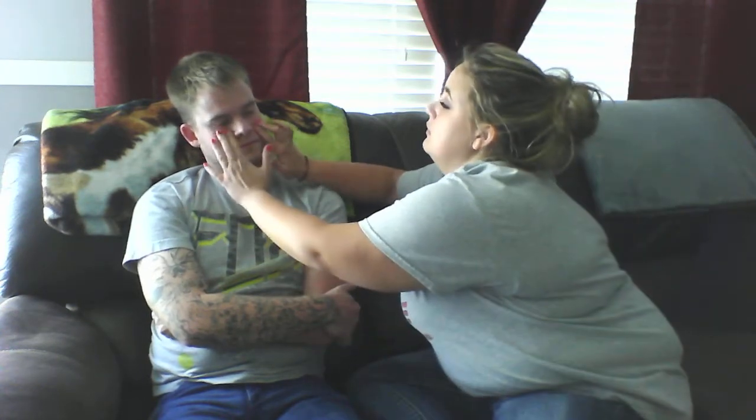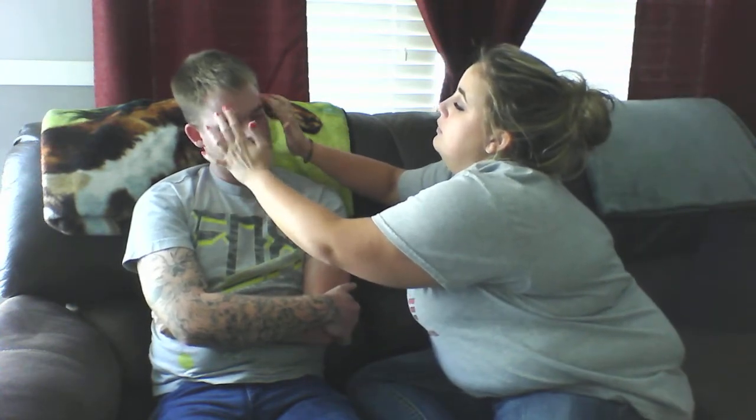We can also assess the nose. In looking at the nose, it is symmetrical, and I can use my lovely little tool here. I don't see any redness, any swelling, anything like that inside the nose. No drainage is present. I can assess patency on both sides of the nose. Breathe in. Breathe in. Okay. So it seems like he's more patent on this side than he is on this side, just based on hearing him breathe. I can also palpate his sinuses once again. I already did.